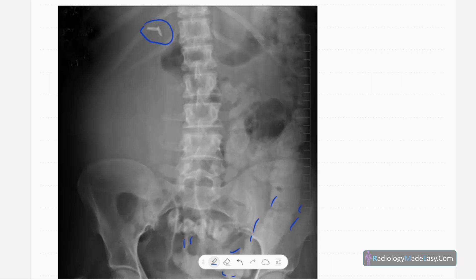When you look closely, there is an ill-defined opacity in the right loin region. Also, the bowel loops are displaced to the left side — most of the bowel loops are displaced to the left due to this opacity.